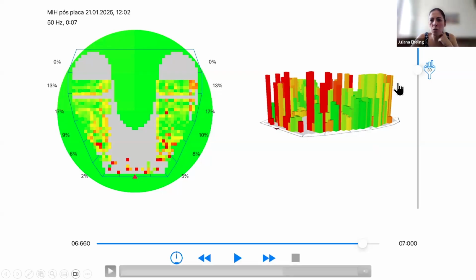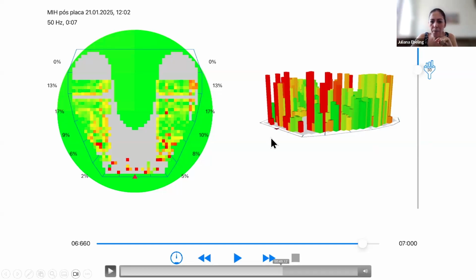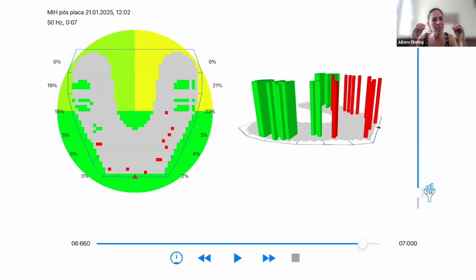So I can use the filter to clear, and then I can correlate the contacts that we have in the mouth with the color transferred by the sensor, and I can filter this contact to see what I'm seeing with papers. Probably it will be this picture that we will see with colors in the teeth, because these are the real contacts that are happening.